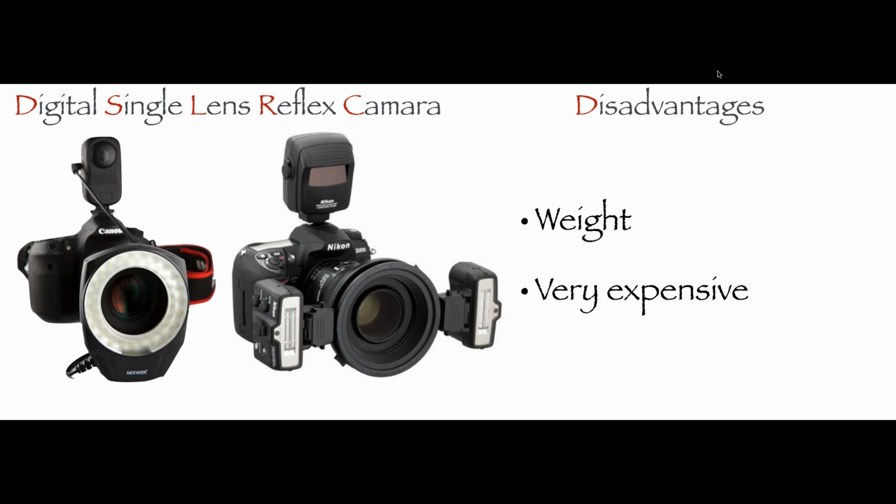Now, obviously, they have a disadvantage, and the main disadvantage that I see on these cameras is not the price, because everything in life has a cost, and with time and with your work, you are delivering a dental service, you will get your money back. That's no questions asked. But one of the main disadvantages is actually the weight of the camera.